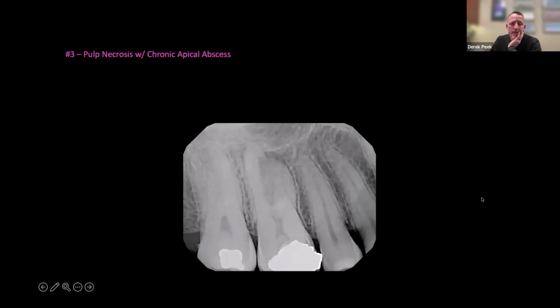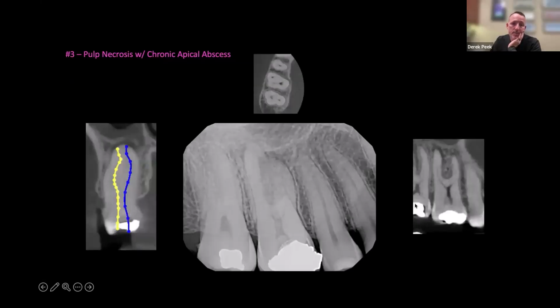One more here. Anytime I see these come off at a pretty sharp angle at the end of the chamber, I know I have to be pretty minimalistic and not use big files. So we're measuring those, getting an idea how long they are.